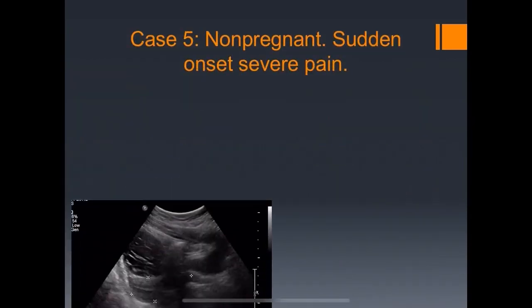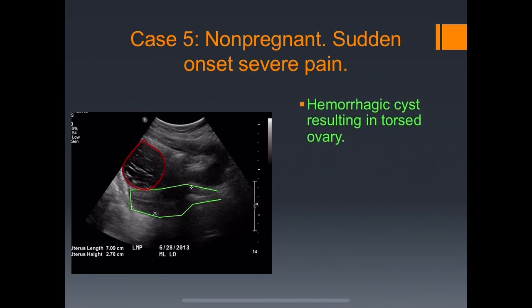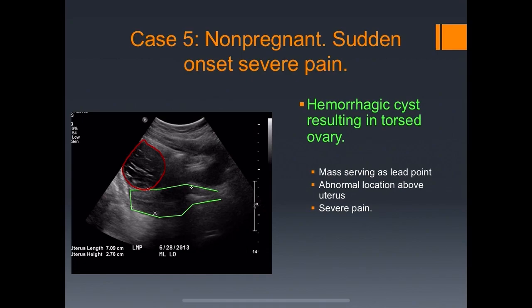Case five: non-pregnant with sudden onset of pain. Transabdominal view shows an anteverted uterus with a structure anteriorly in an abnormal location. This is a hemorrhagic cyst serving as a lead point resulting in a torsed ovary. Abnormal location above the uterus, severe pain, and no flow was seen in this case. Again, a reminder: an arterial waveform in an ovary does not exclude the diagnosis of torsion.